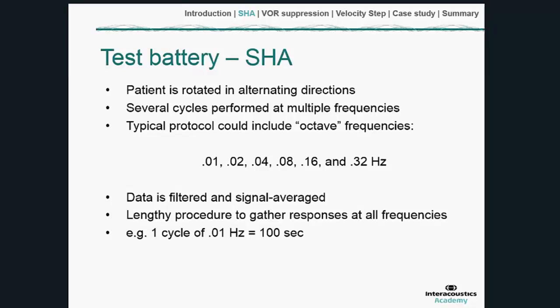And that's because, certainly at the lower frequencies of oscillation, one cycle at 0.01 hertz would be 100 seconds, and we might do 2 cycles at each octave frequency. So you can see quickly the test time will build up there.